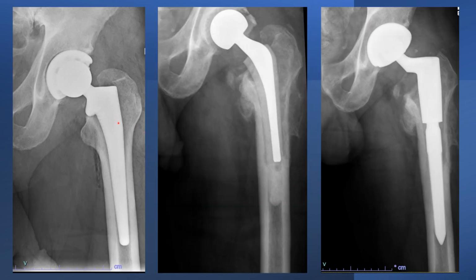Final example, here we have an infected hip replacement. These are, again, well fixed, and so there's a lot of work in taking out well fixed implants. The hip has to be debrided and washed out. The patient will go on a course of antibiotics once the spacer is in place. Once it's clear that the laboratory values have normalized and the antibiotic course has been completed, the patient can be a candidate for reimplantation. And the actual stem that we choose will be based on the amount of bone deficiency and the amount of bone remaining. There's a lot of deficiency in this patient approximately, and so we'll use a distal bypass stem to compensate for that, and we can use a straightforward press-fit cup.